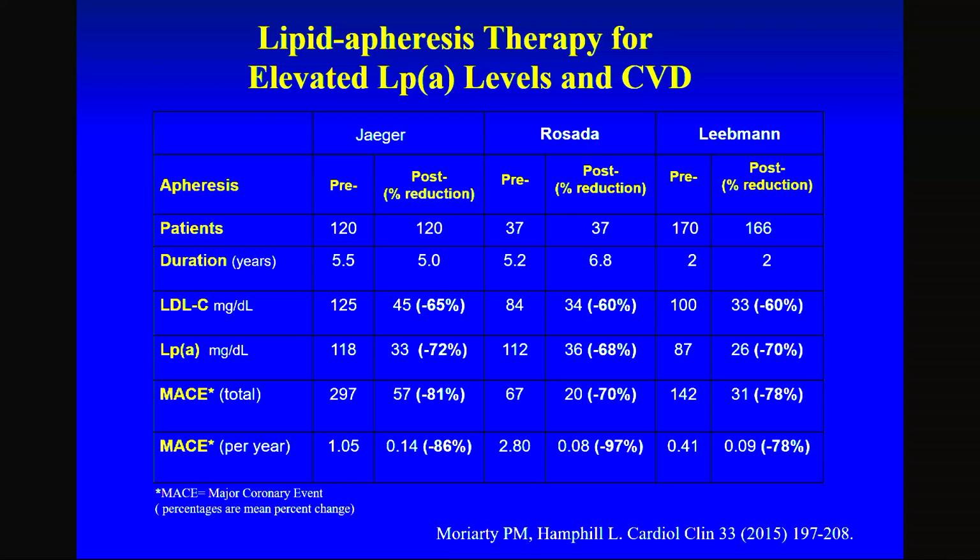They thought we'd lower the LDL too much. So we kind of made a compromise, and we're waiting to hear back. It takes 180 days, so we should hear back at the beginning of next year. So we might be seeing lipid apheresis being used for this orphan patient population that right now has no therapy.